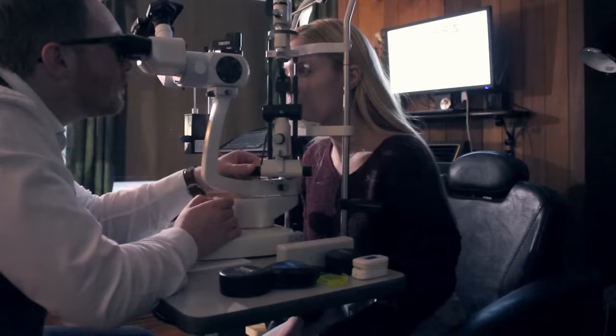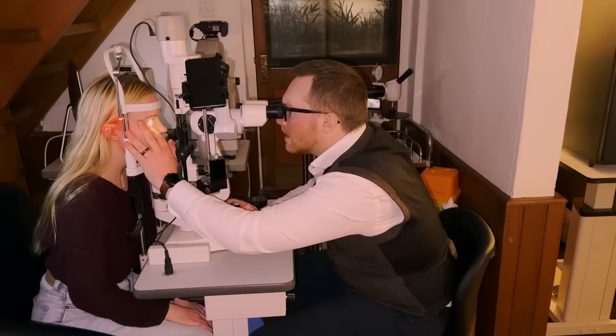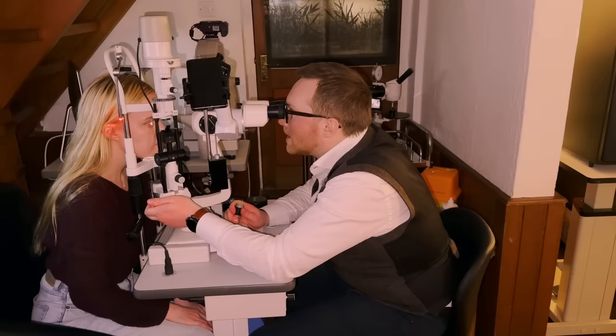And if I get you to look over to your left, and over to your right, straight up at the ceiling, gently going to lower this eyelid, and looking down, very good, looking straight ahead again. I'm going to get you to blink and then just stare for as long as you can for me. Seems easier said than done when someone's shining a bright light into your eyes. Very good.